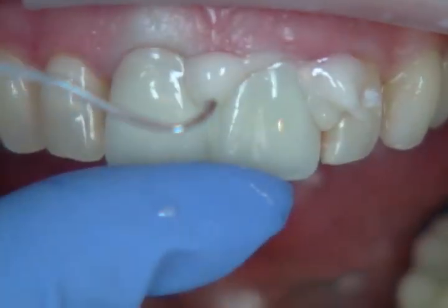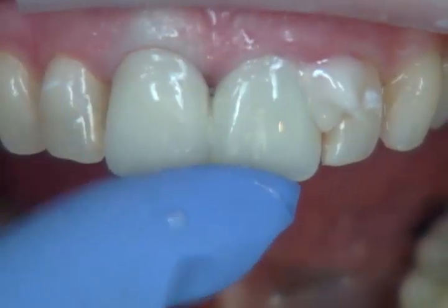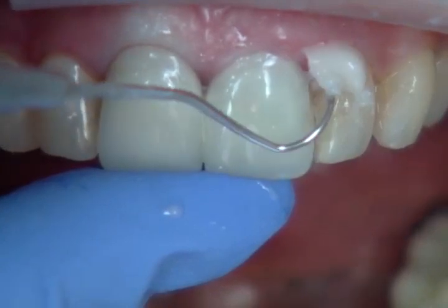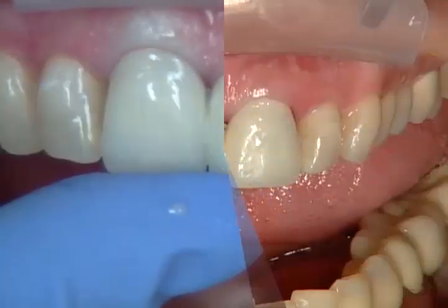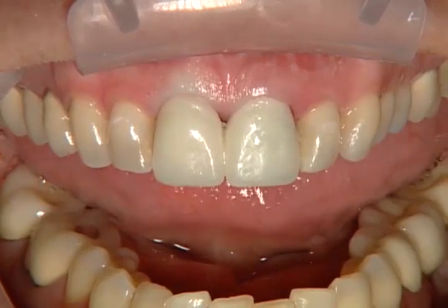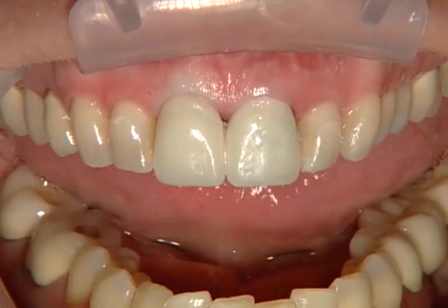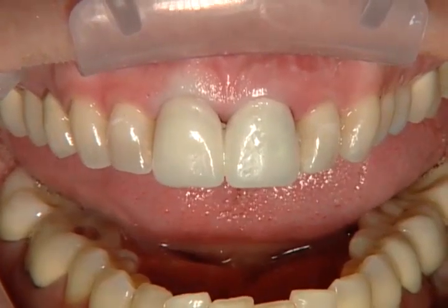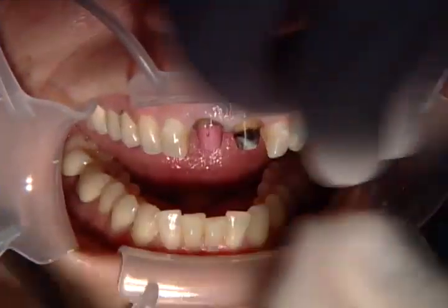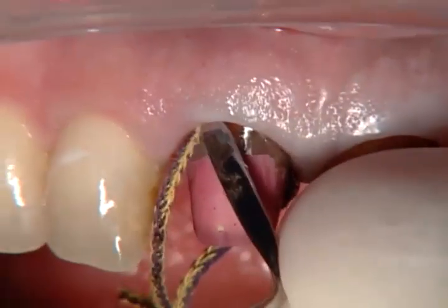This is about the only time you can do this is on 2 or maybe 4 units with the bisacryl. Otherwise, we're going to want to use an acrylic that goes through the doughy stage. We're okay using the bisacryl because we don't have any undercuts on the tooth, and it looks like we're not going to lock them into place. The biotemps look nice. The teeth are now the same length again as they were supposed to be. We can have adjustments made on the gingival level if we want, if we're going to do any tissue recontouring. And now we're ready to impress because it's been 2 weeks and we're at the next appointment.